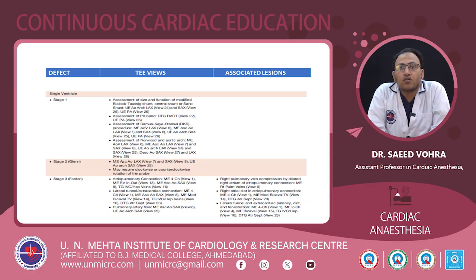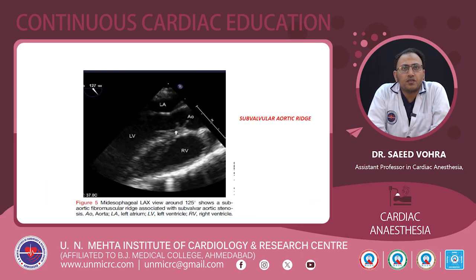Right atrial clot in atriopulmonary connection can be seen in the mid-esophageal 4-chamber view, mid-esophageal modified bicaval tricuspid valve view, and deep transgastric atrioseptal view. For lateral tunnel and extracardiac patency, to check the patency of the tunnel, and whether clot or fenestration is there, the mid-esophageal 4-chamber view and 2-chamber view along with the mid-esophageal bicaval view and transgastric IVC hepatic vein view will be helpful. These are some of the images of the lesions.